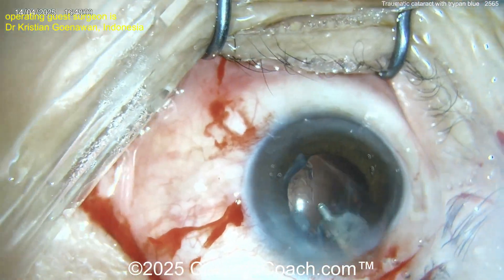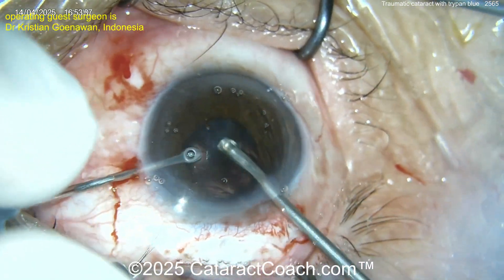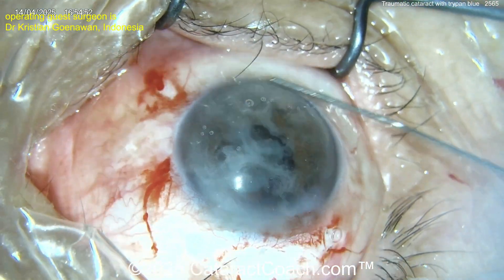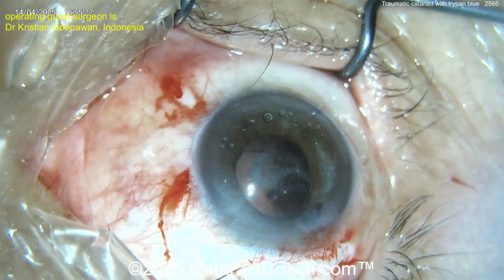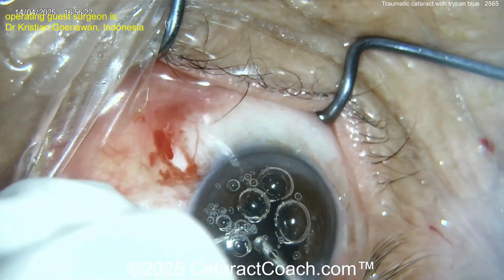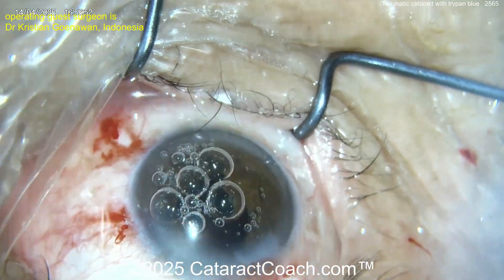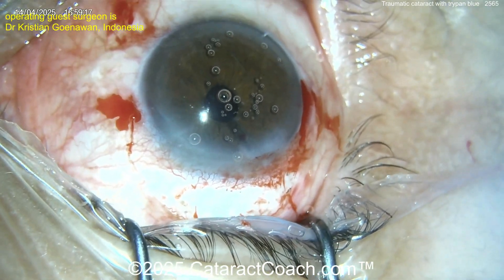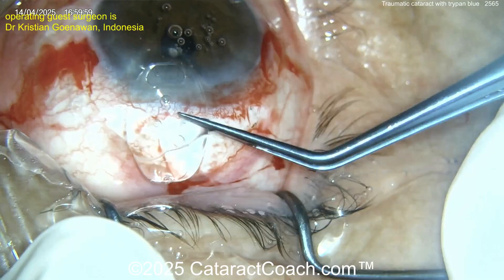As you start to remove the vitreous, the nucleus can get farther and farther away from you. Here doing a bimanual anterior vitrectomy — and there it is, triamcinolone — that helps, that looks pretty clean actually. Take your time here. This patient had basically an intracapsular extraction — the entire capsule came out with the nucleus. Now once it's cleaned up, time for the IOL.